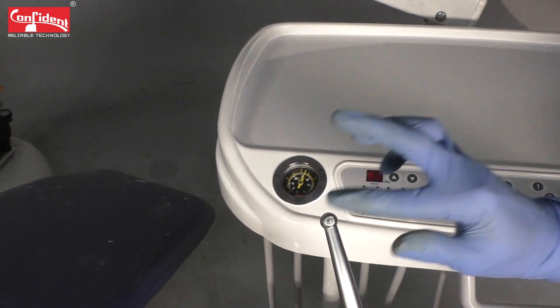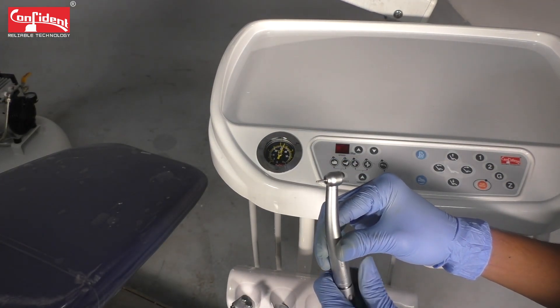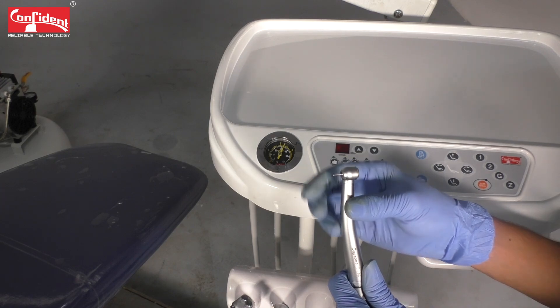Now check the air rotor by gently feeling the handpiece. You can observe that it has attained enough RPM to do the procedure.